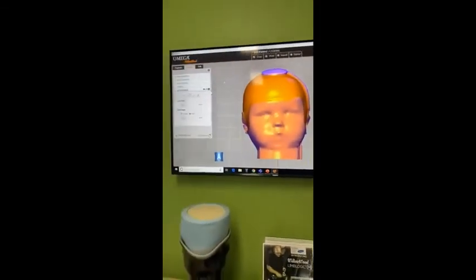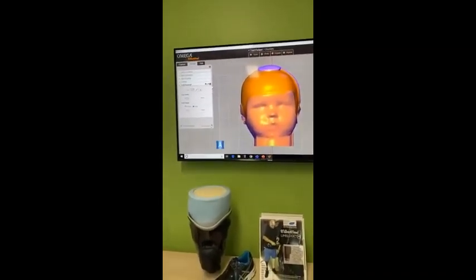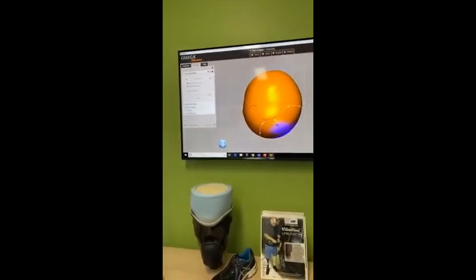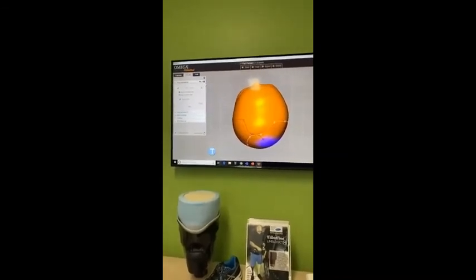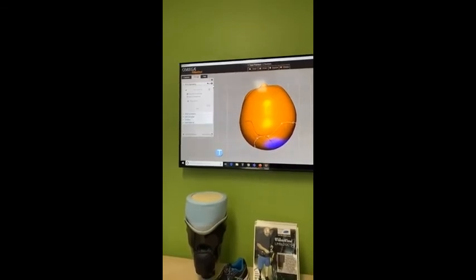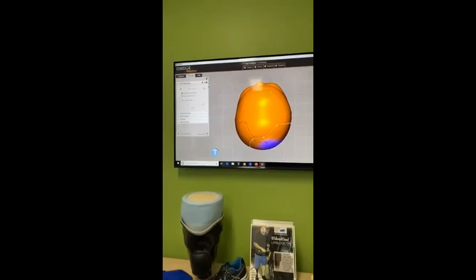So with cranials, we're at the end of the design stack here, so we will start at the top. So basically what we're trying to do is correct the low point. So what we do is we copy the area of the high point, we mirror it to the low point side, and then we contour that, and we do that for the back and for the front.